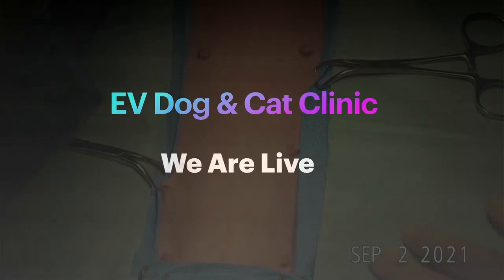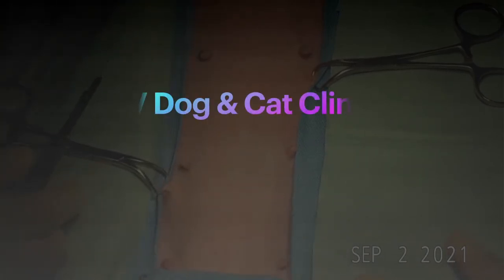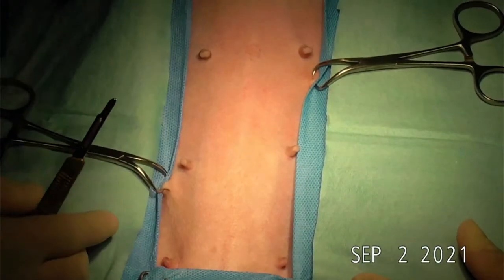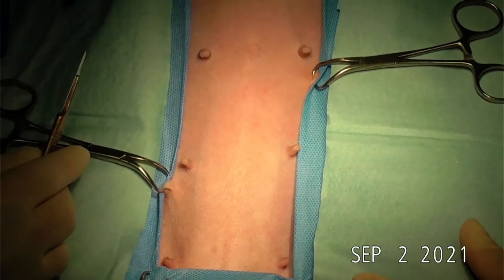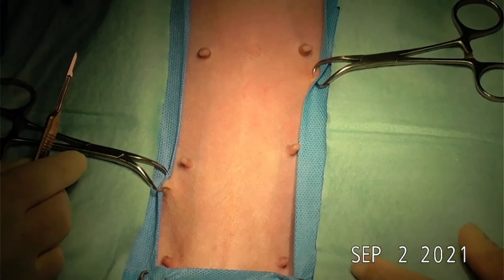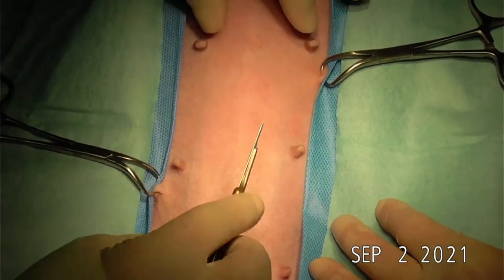But in most cases, a needle without a thread can be passed through the feces. But some patients with this condition, having ingested a sharp object, especially a sewing needle, might have it lodged on a loop of the intestine, and we are worried if it has the thread attached. So let's open it and check.